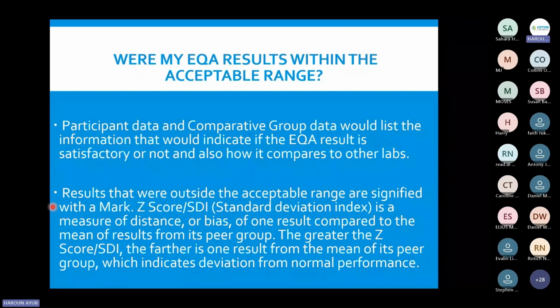We'll also focus on whether you have any peer grouping in that particular report, and see which peer group is best characterized to view your report. Let's say you have several results under the same peer, for example HB results: you get general, instrument, method, and reagent groupings.